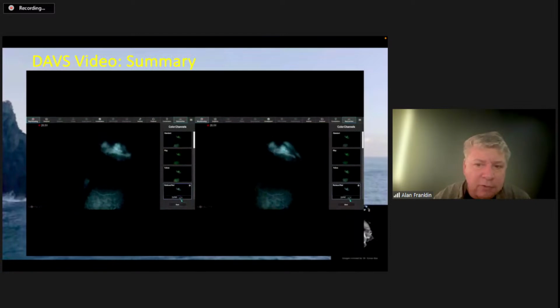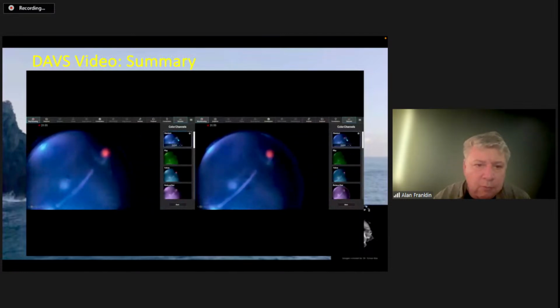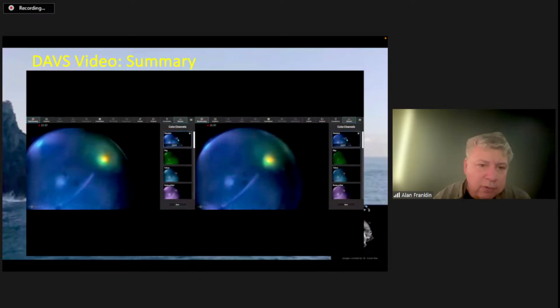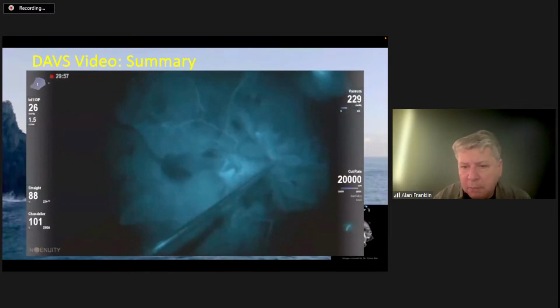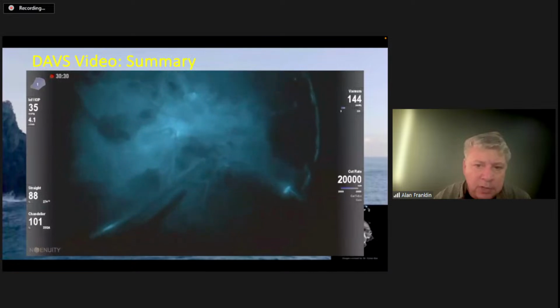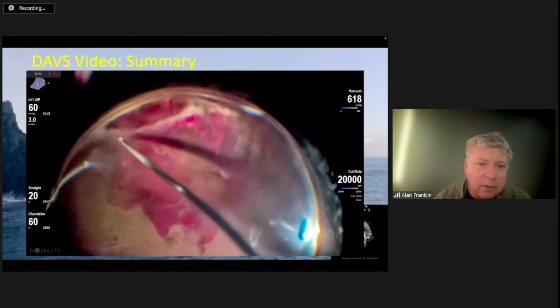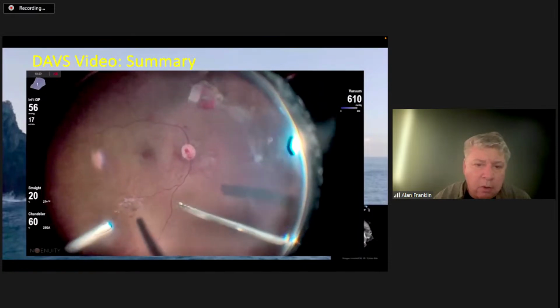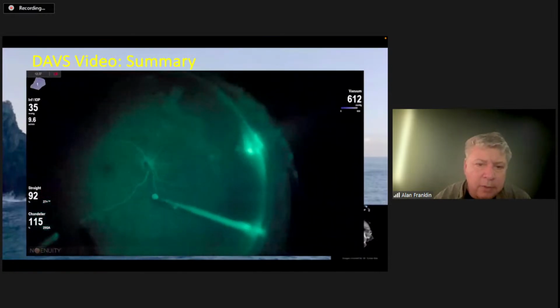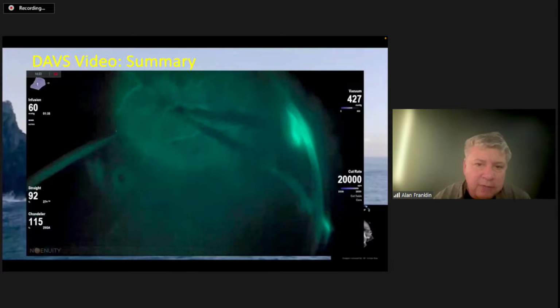This was a diabetic vitreous hemorrhage. We didn't see an exact source, but with fluorescein, as we go into the periphery, we can see this residual peripheral neovascularization, which we treated confluently and then treated the retina peripheral to it, and we had long-term good hemostasis. Here we're peeling the membranes under fluorescein, and you can see that the membranes appear white, and underneath the tissue is dark. So you're really seeing excellent contrast.